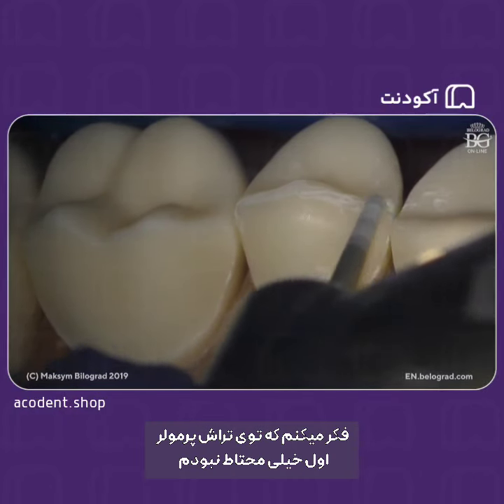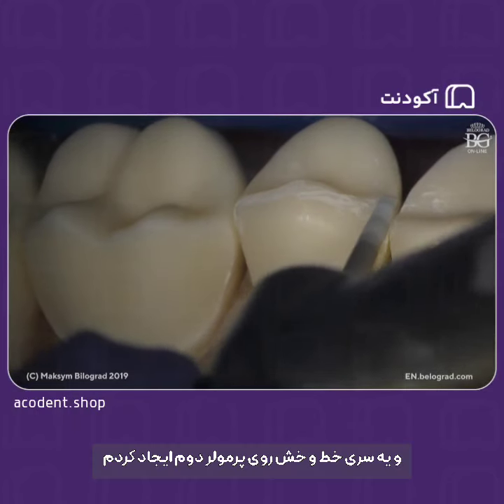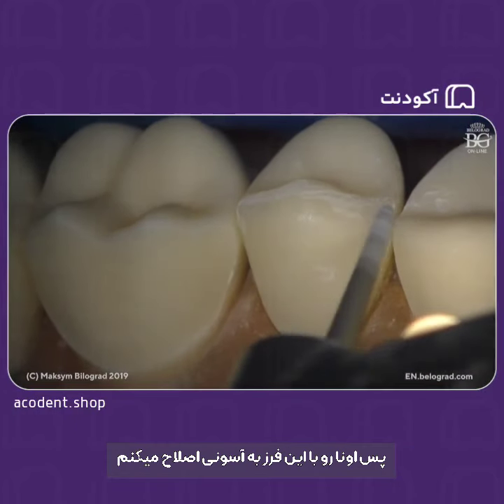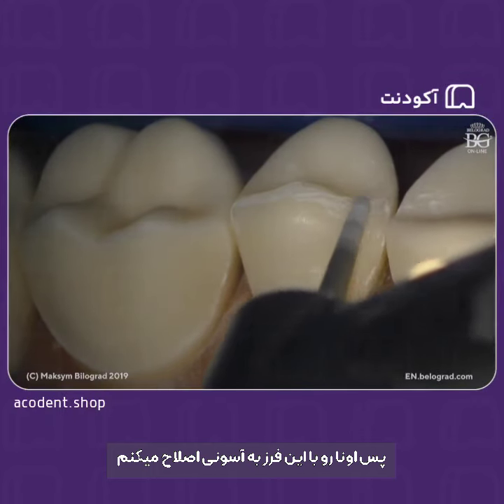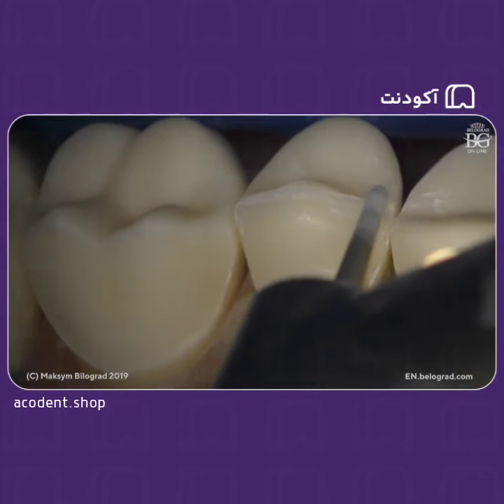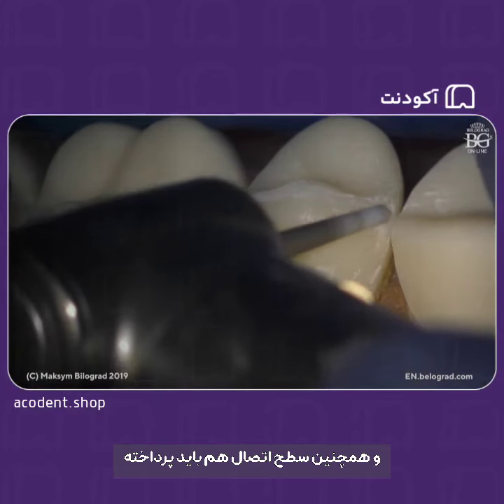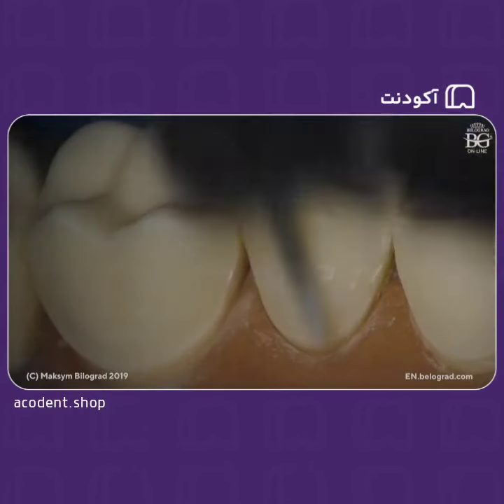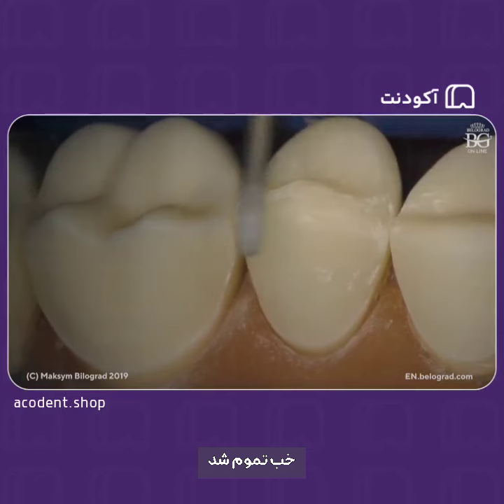I think that I was not accurate during the preparation of the first premolar, so I have some scratch here on my second one, so I can improve this one with this burr easily. Okay, and also that transition has to be fine and visible. So done. I think that we're done.